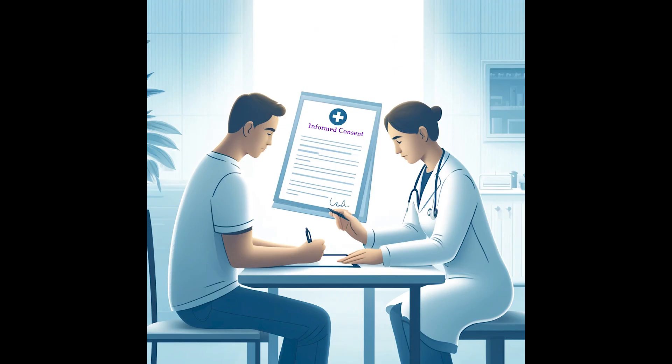The first step is to correctly identify the patient undergoing an ECG. The patient should be given a brief overview of the procedure, and informed consent may be required according to local guidelines.